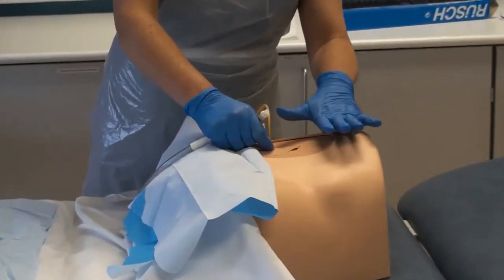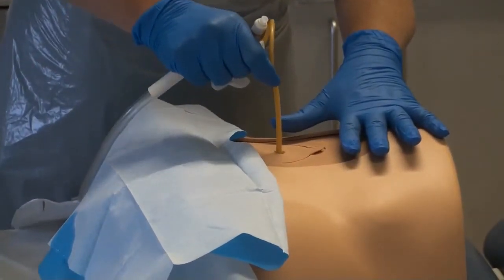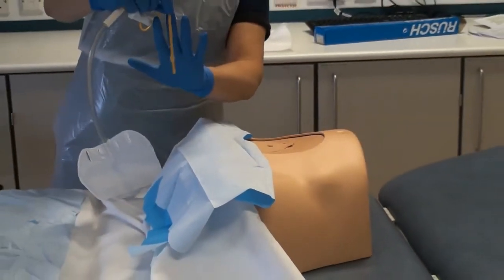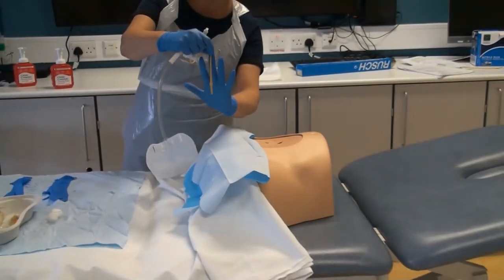Prepare to remove the catheter by placing the fingers of your gloved hand on either side of the catheter, as close to the suprapubic site as possible. Grip the catheter and gently remove the old catheter in an upward direction with a slight rotation. Judge the length of the catheter removed and the angle for reinsertion.